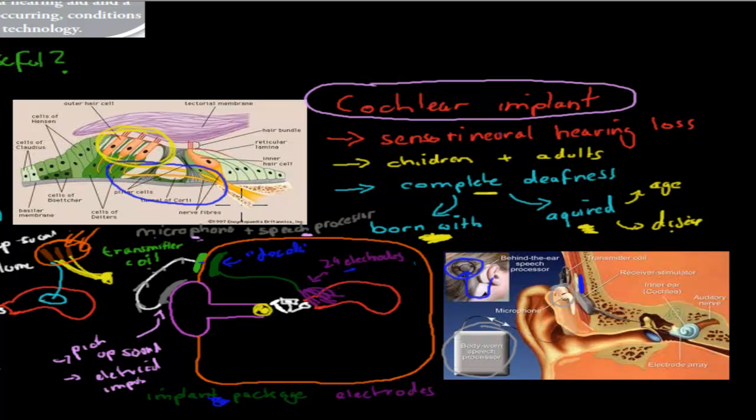these nerves, right? So in this case, the cochlear implant is given when these sensory parts, so the hair part, are not working at all anymore. So they're not moving at all, they're broken, maybe due to old age or disease, right? So these are not working at all. So what this whole technology does is it activates these nerve fibers directly, right? So without having this hair activate them, this technology will activate them directly through the use of these electrodes.